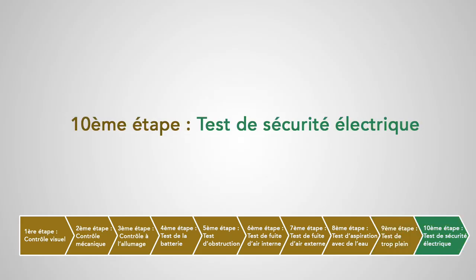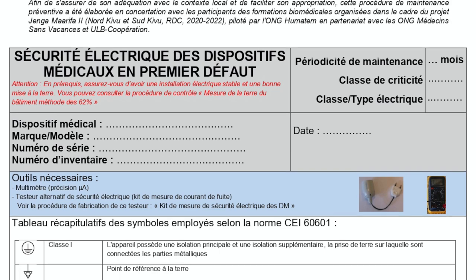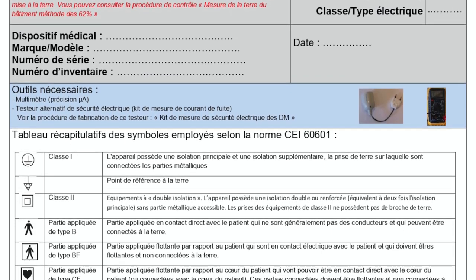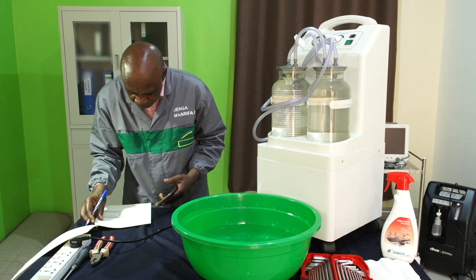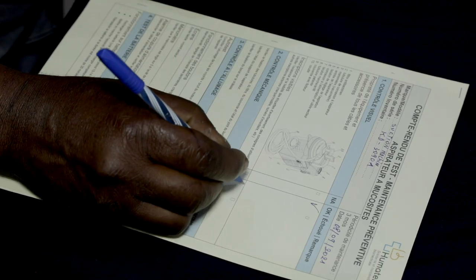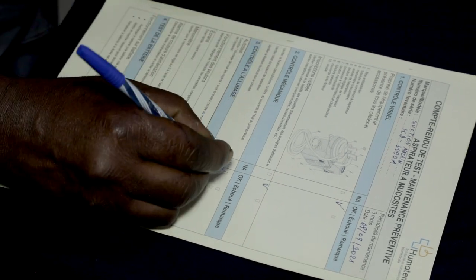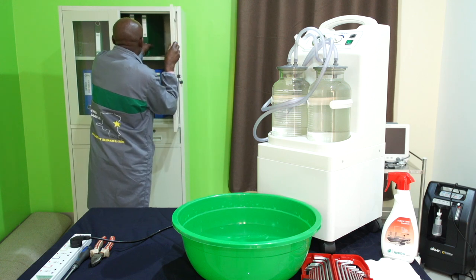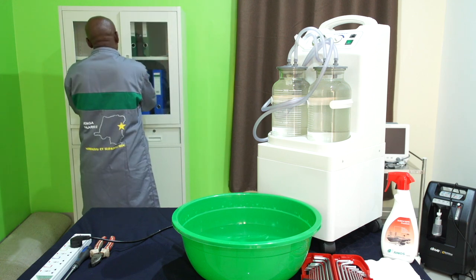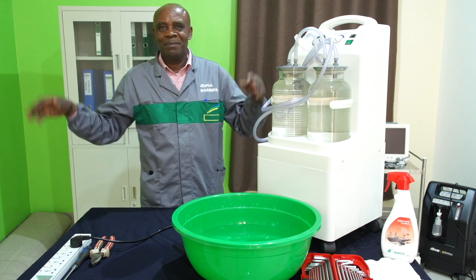Dixième étape : test de sécurité électrique. Nous vous renvoyons directement vers la procédure sécurité électrique que vous trouverez en lien sous la vidéo. Une fois toutes ces étapes vérifiées, n'oublions pas de compléter et d'archiver notre compte rendu et d'enregistrer les résultats de cette maintenance dans nos outils de suivi. L'appareil ne peut être rendu au service utilisateur que si et seulement si toutes les étapes sont validées. À vous de jouer !